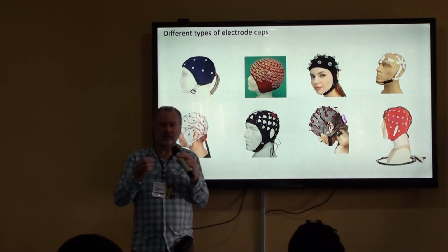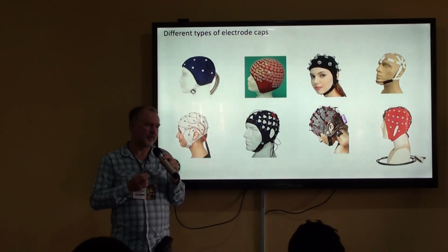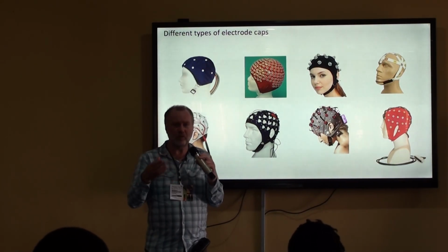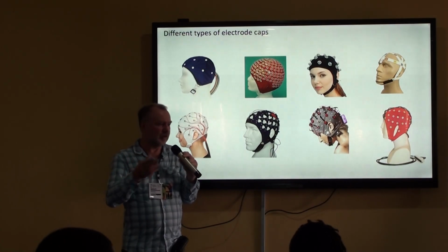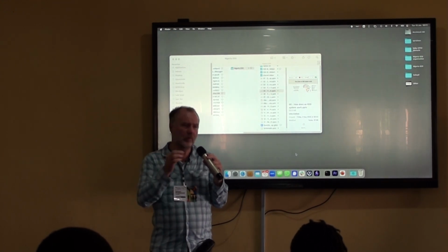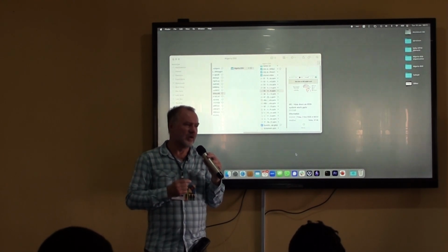So we don't need electrodes that stay good for more than 1.5 hours. If we do the baby recordings, the babies are not going to sit still for more than 10 minutes. So that means that we don't need electrodes that stay well for more than 10 minutes. So that's why for the baby recordings, the sponge-based electrodes are good. Whereas for adult recordings, I would say, well, they're good for shorter experiments, but not for the longer experiments.